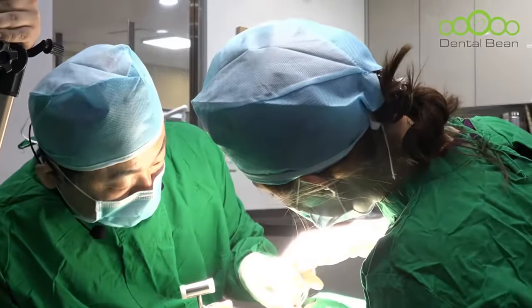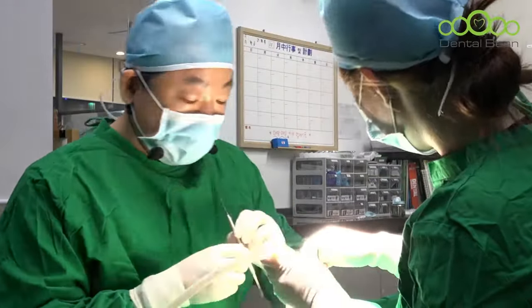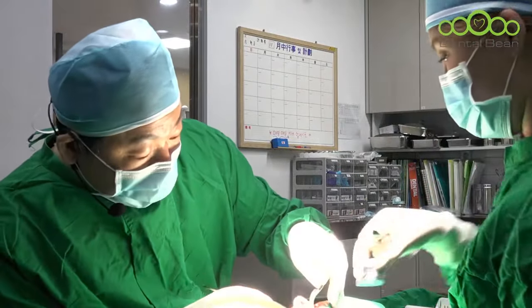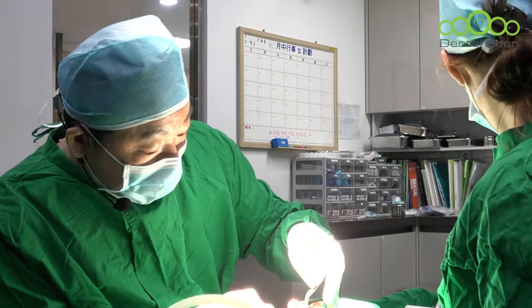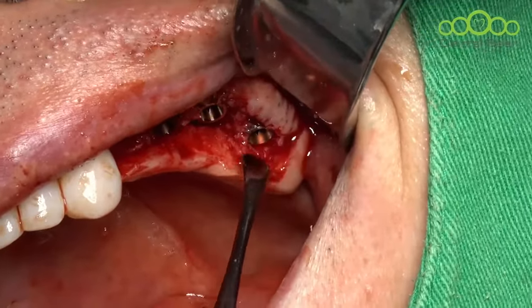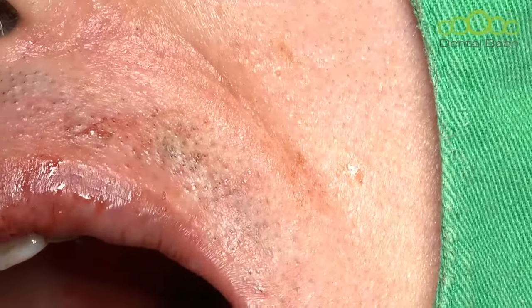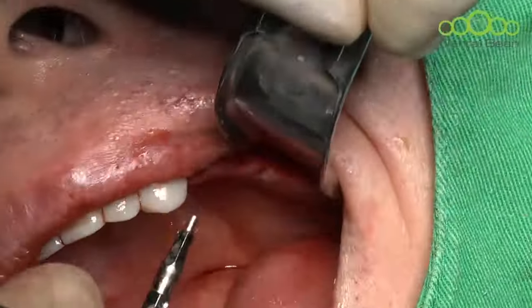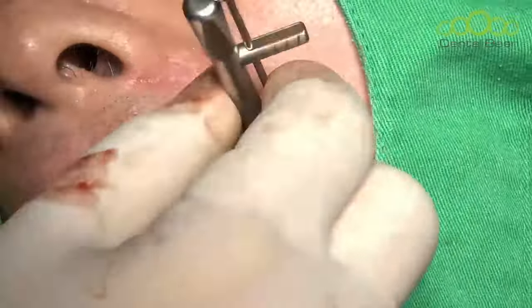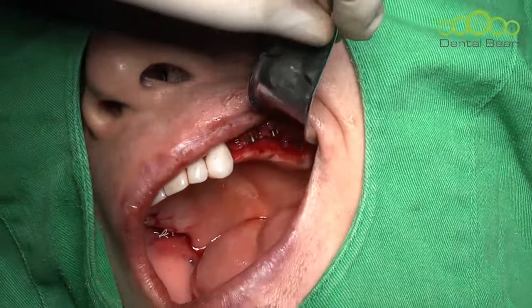Turn to the right side. I didn't expose the well. Let me check. I must expose here. The soft tissue looks very thick. Maybe I have to reduce the soft tissue thickness in here. First, it is better to place the implant deep. Okay, place the implant deep, then alveoloplasty, and reduce soft tissue also. Okay, placed the implant deep. Hold on.